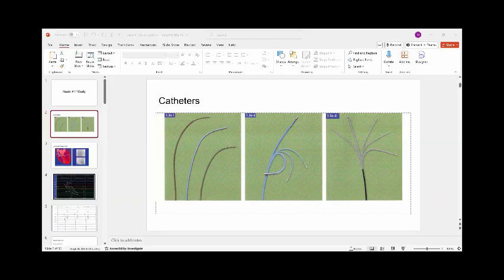This is an example. Here I have a P wave, QRS complex, a normal P wave. Then I have a premature beat, then a sinus beat. Then I have an atrial tachycardia. How do I know this is atrial tachycardia? I have an abnormal P wave. It's the initiating cause of the tachycardia. So from this ECG, mostly this is atrial tachycardia.